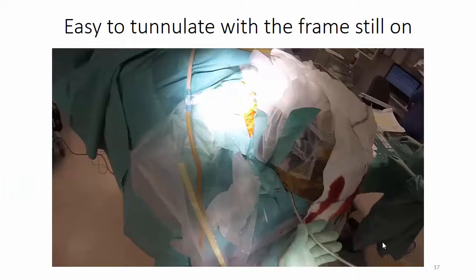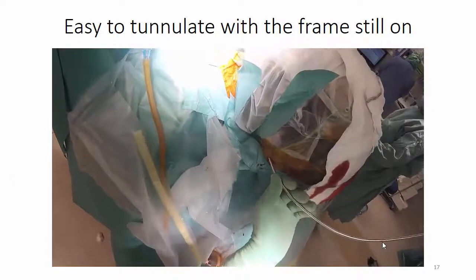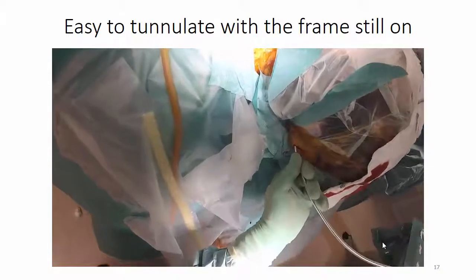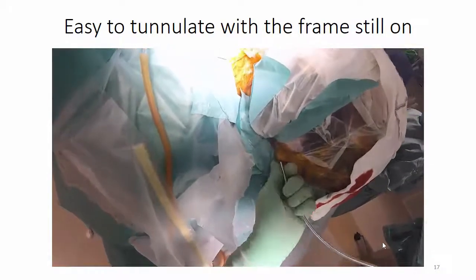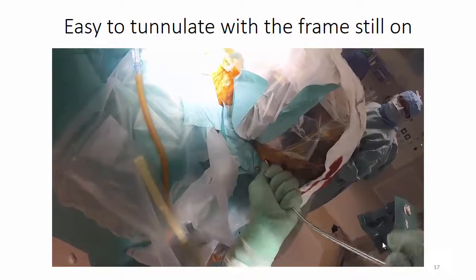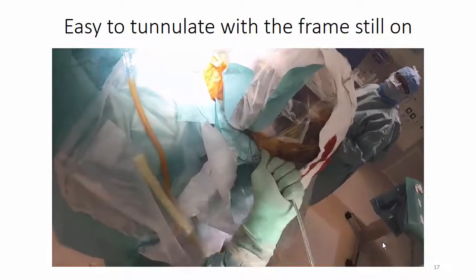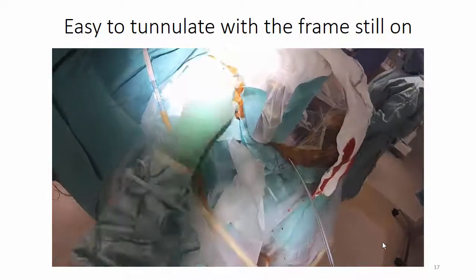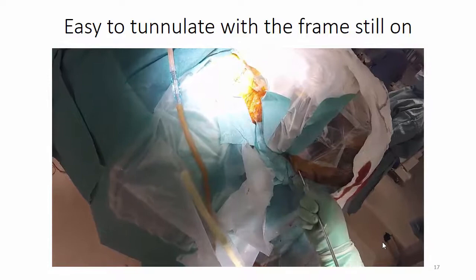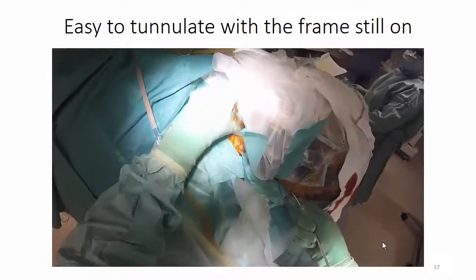Since the tunnelation tool can be shaped as desired, it is easy to perform the tunnelation without removing the stereotactic frame, as seen here — and this saves a lot of time. A plastic tube is placed over the tunnelation tool before tunnelation and then left in place when the tunnelation tool is retracted.